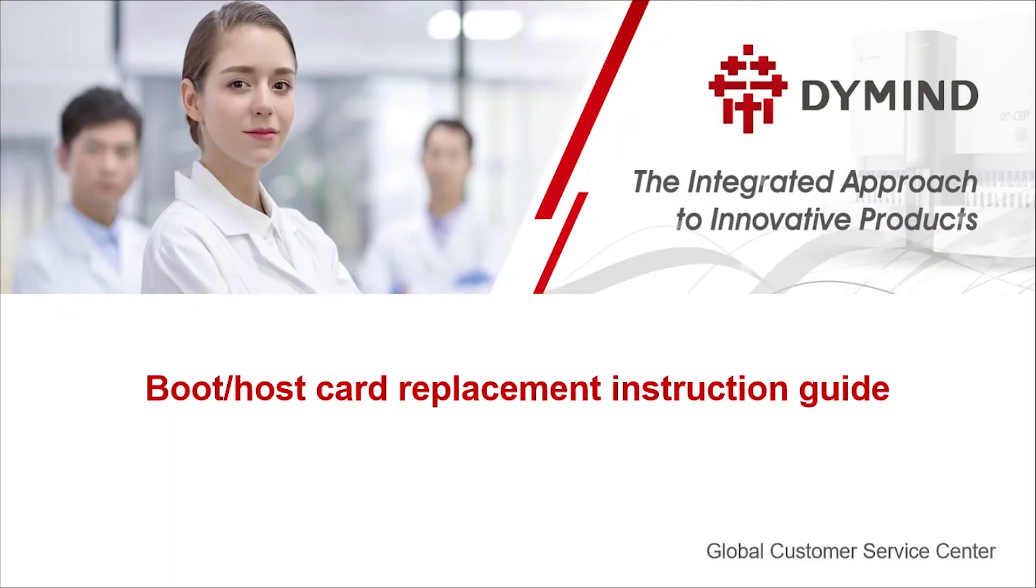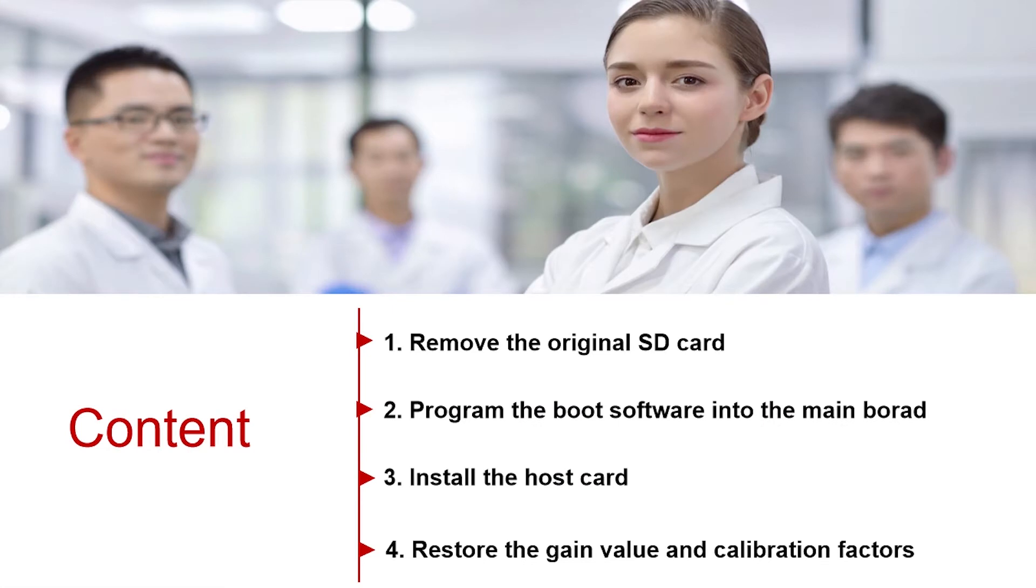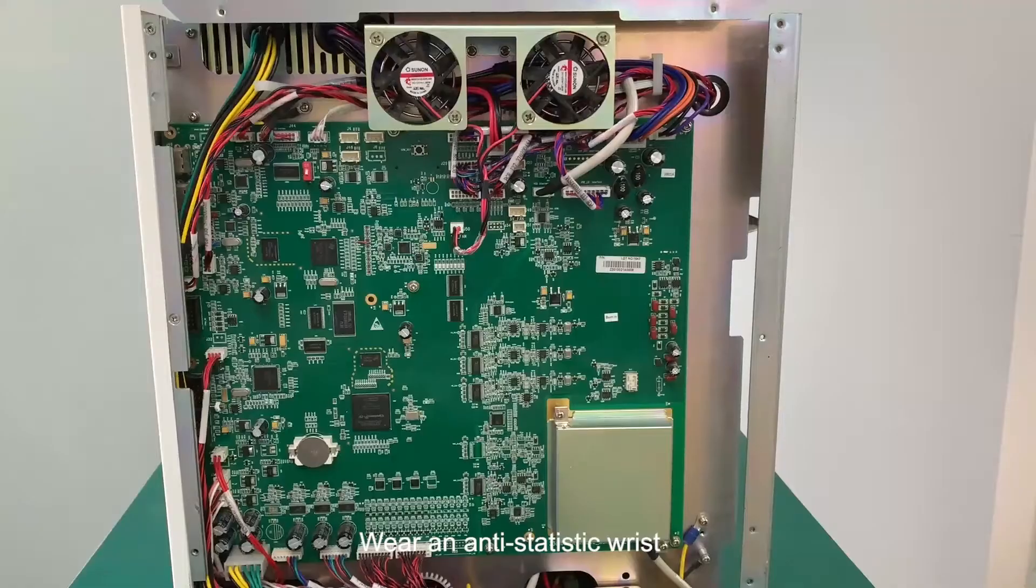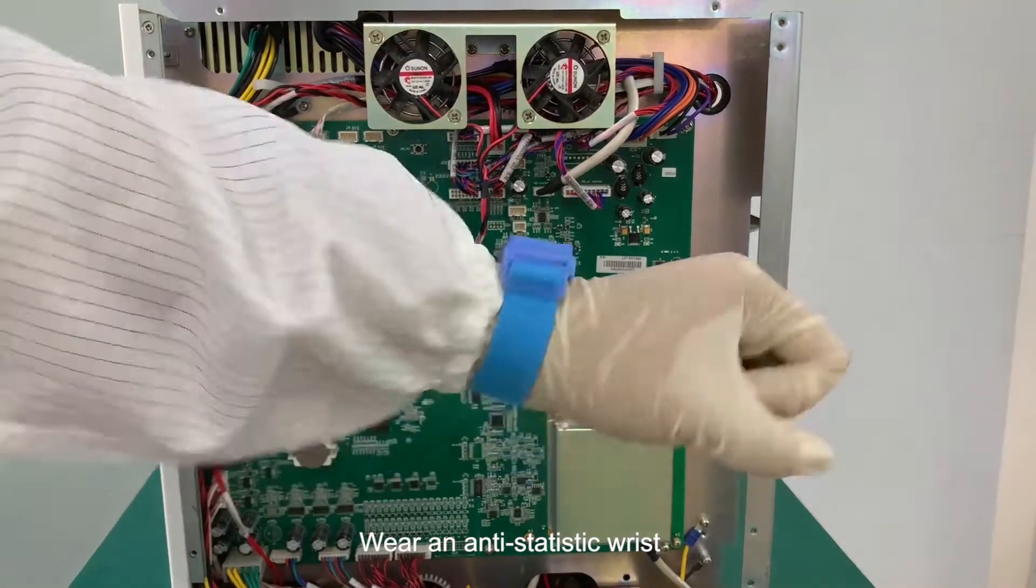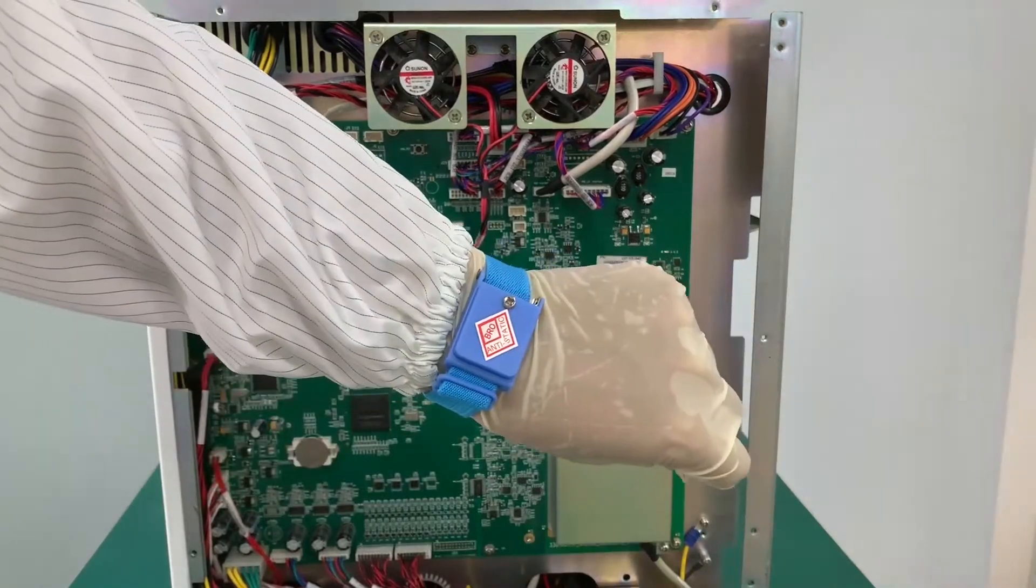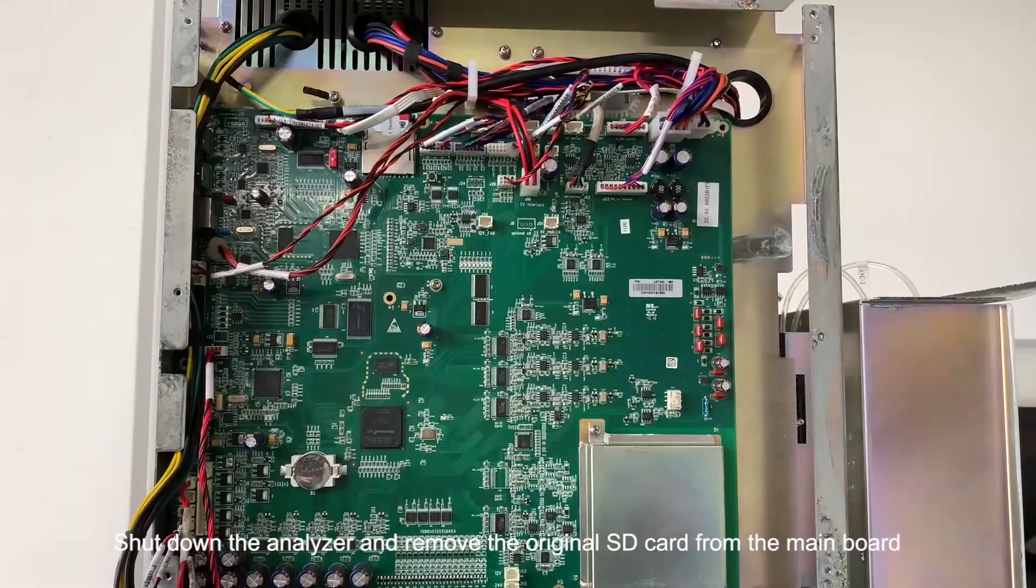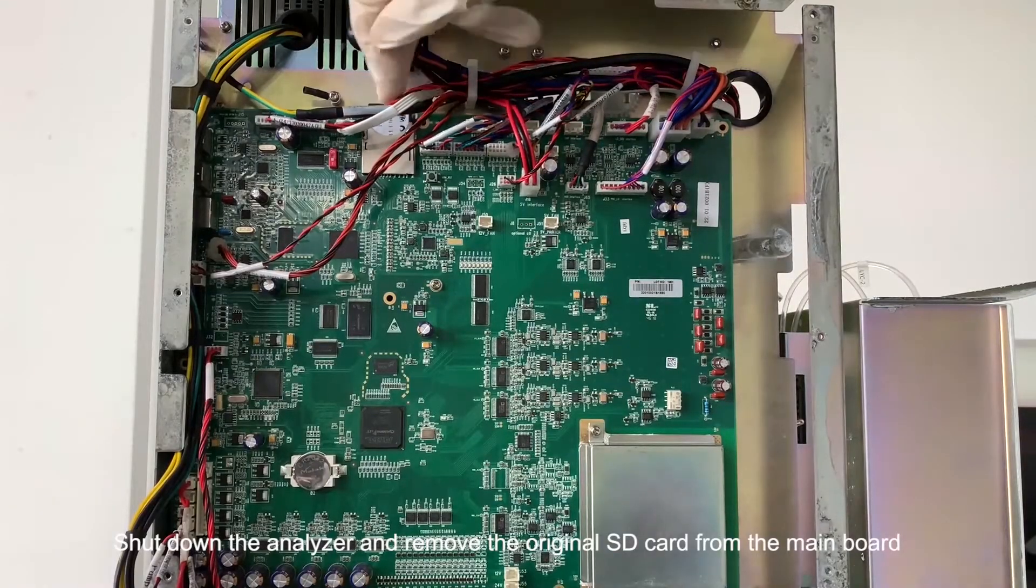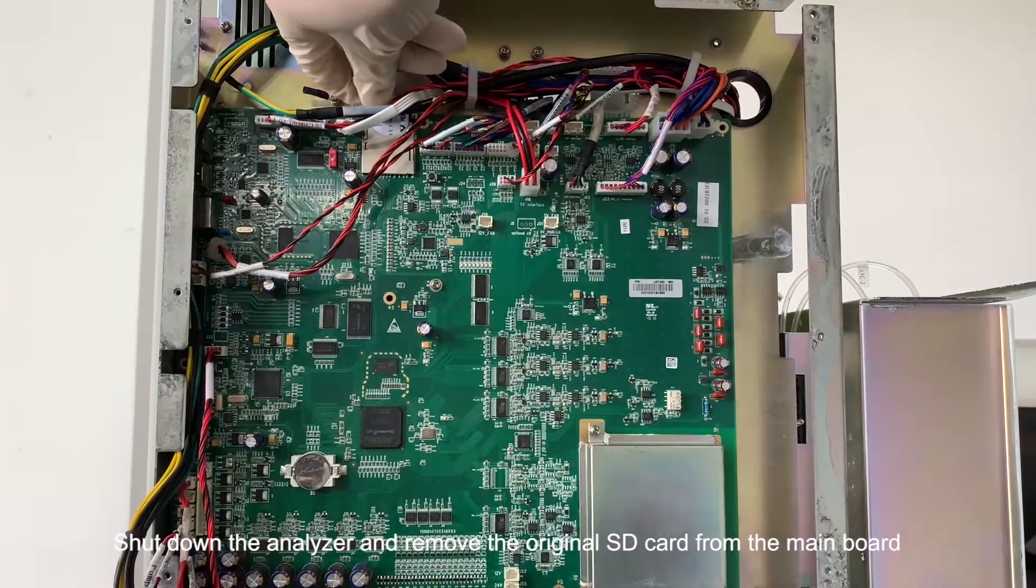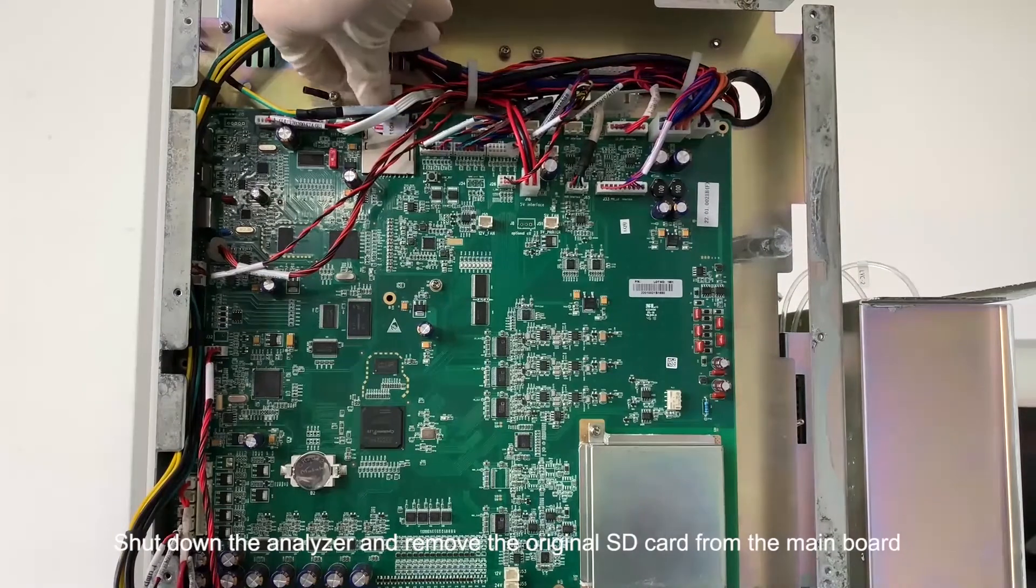This video shows how to replace boot and host SD card. Wear an anti-static wrist strap. Shut down the analyzer and remove the original SD card from the main board.